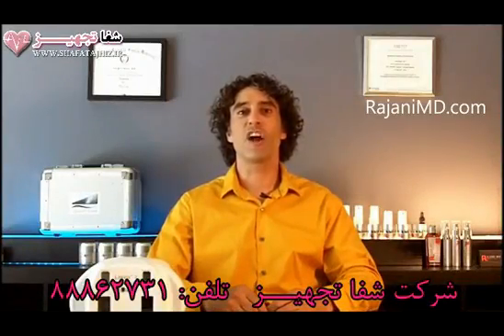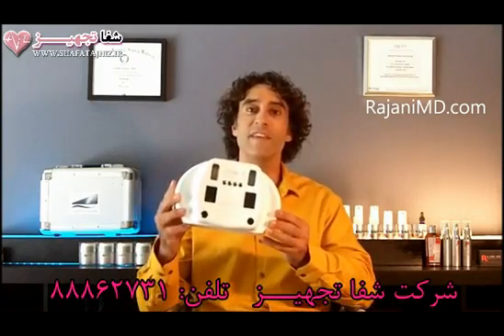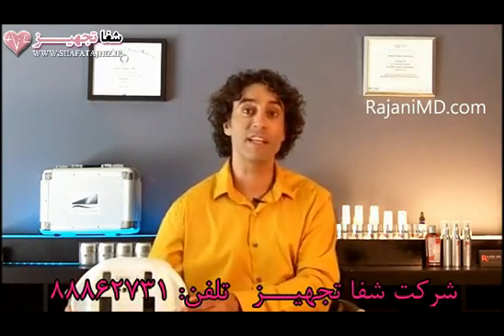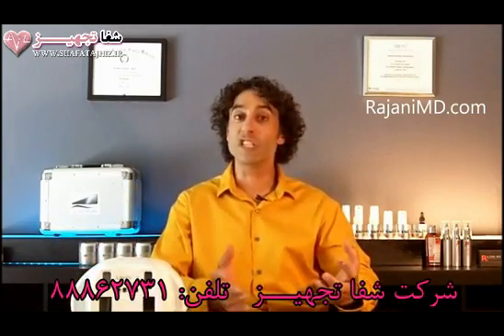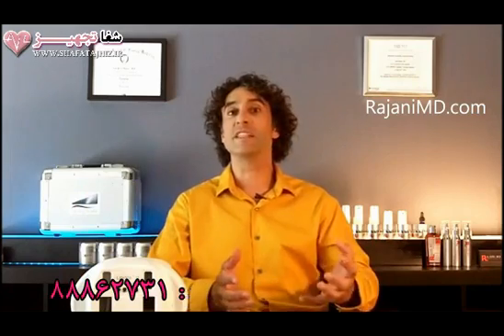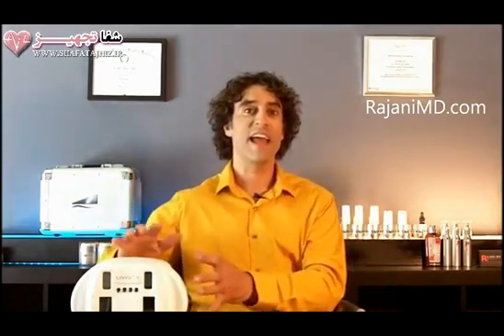Hi, I'm Dr. Rajani, and today I'm talking to you about the Quantificare 3D Viewer. It's the most used device in my clinic simply because when patients come in, the number one reason they wouldn't do a treatment is uncertainty, or they're scared about the way they're going to look after the procedure. And this takes that anxiety and that fear and removes it from the consultation process.